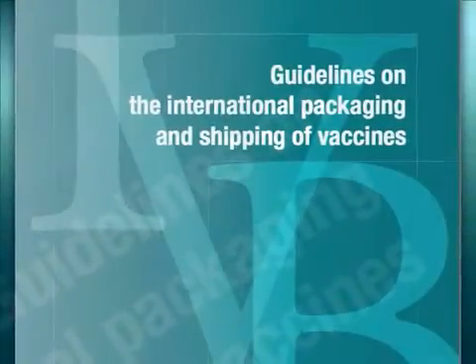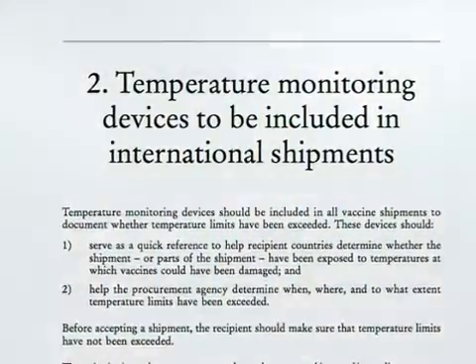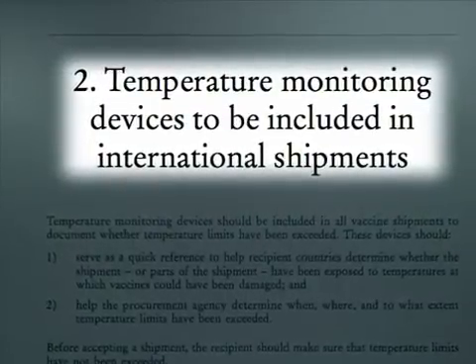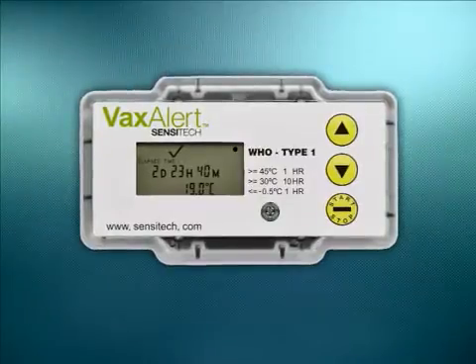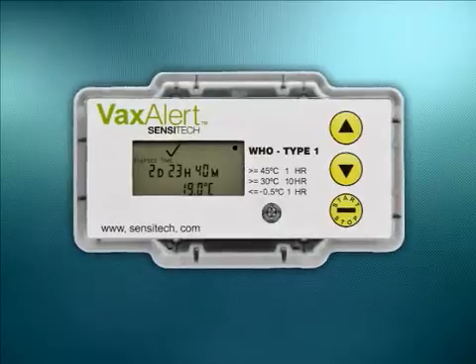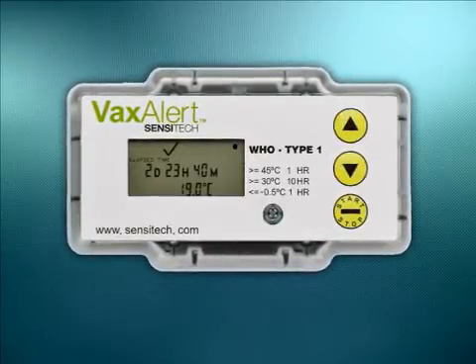According to WHO guidelines on the international packaging and shipping of vaccines, a 10-day electronic temperature monitoring device should be included in each international vaccine shipping carton. The 10-day electronic shipping indicators show when and to what extent set time temperature alarm conditions have been violated. This video gives a step-by-step demonstration of Sensitech's Vaxalert temperature indicator.